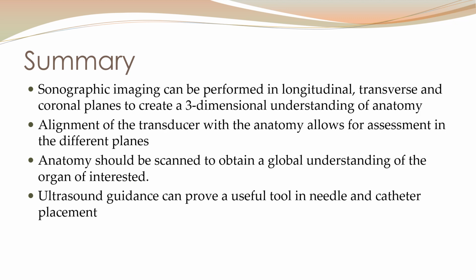We also have to be familiar with the idea that in order to really ensure that a finding is real, is a true positive, we need to make sure that we're assessing that finding in two different planes at least 90 degrees to one another. Anatomy should be scanned to obtain a global understanding of the organ of interest, always before imaging just one certain area.